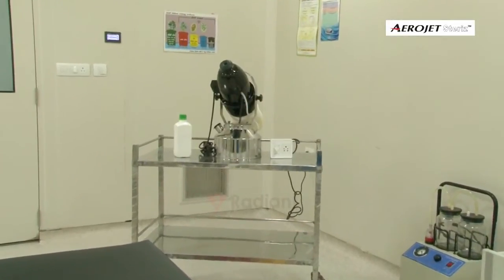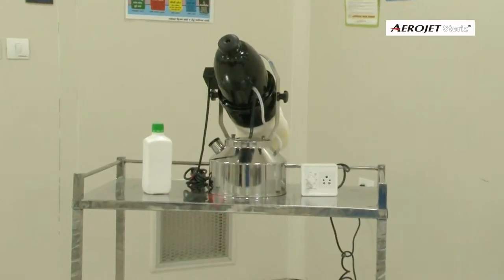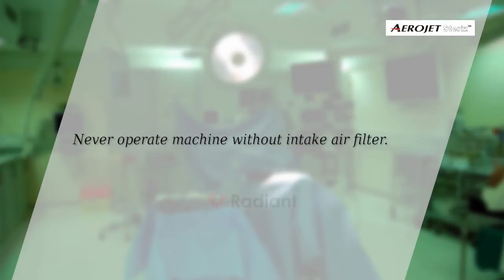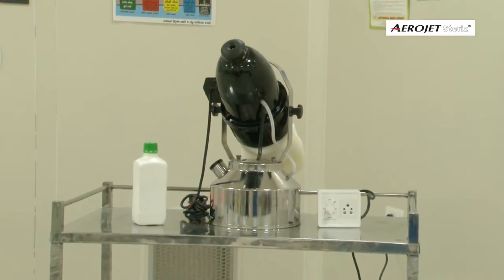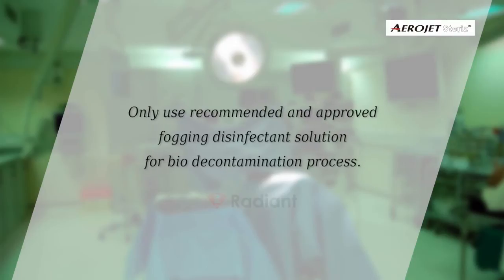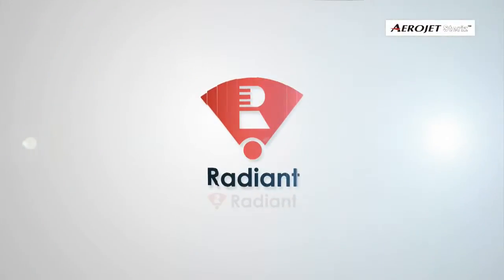High-speed motors of the machine should not be kept running continuously for more than an hour. Never operate the machine without the intake air filter. Our machines can be used with many leading environmental disinfectant formulations and brands, but only use recommended and approved fogging disinfectant solutions for the bio decontamination process. Contact Radiant Enterprise for better understanding and guidance.